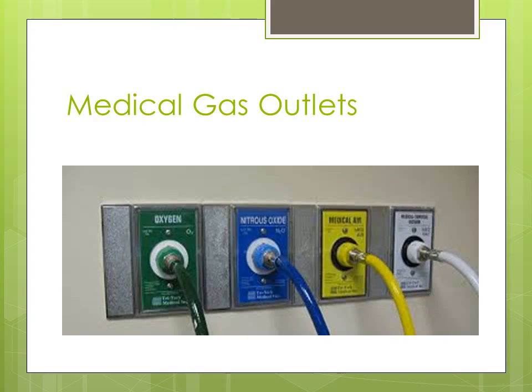It was a bit expensive, but again, you've got to be careful when you go from one construction project to another construction project that you standardize your outlets, and in some cases upgrade them, because some of these older style outlets do have some inherent issues, and some of the newer style outlets obviously have more safety features in them.